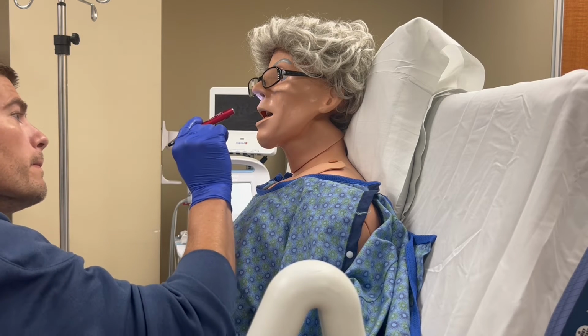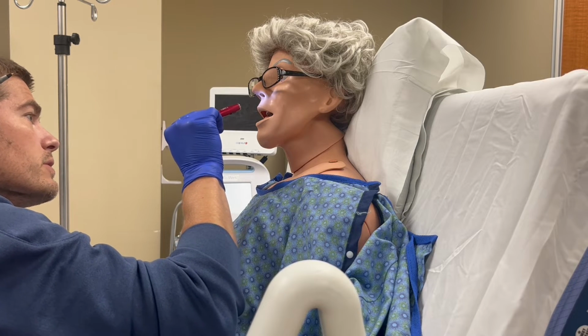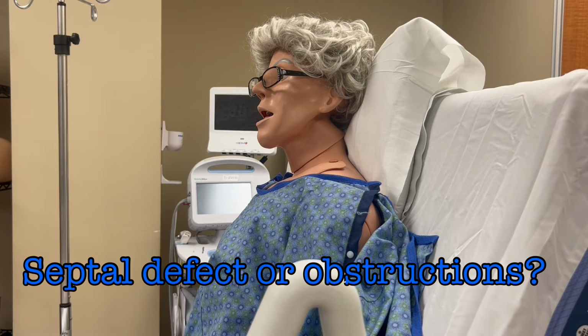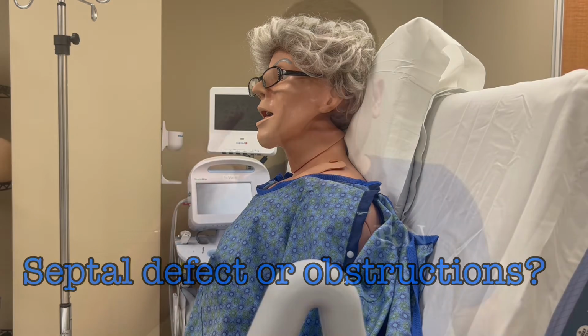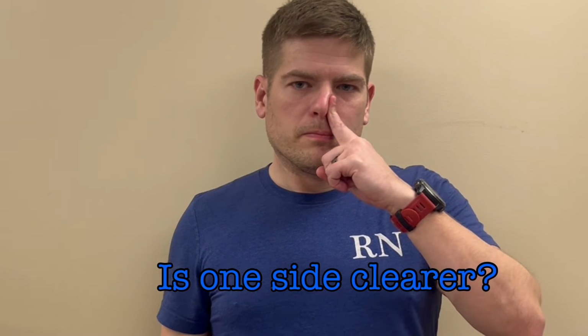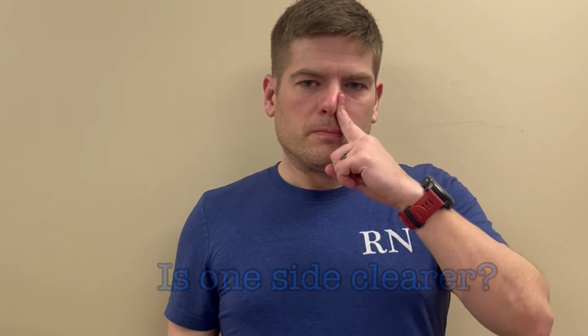Assess the patient to decide which nare you will use. You can use a pen light to look into the nose and see if you identify any septal defects, but you may not know how to identify those anyway. At the very least, ask the patient if they can breathe better through one side of their nose. Have them plug each side separately and breathe through the open nare. Listen to their breathing. Does one side sound more strained than the other?